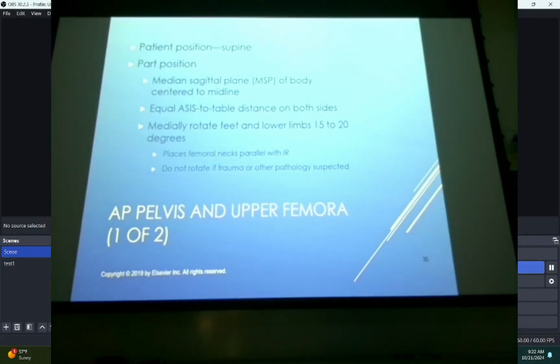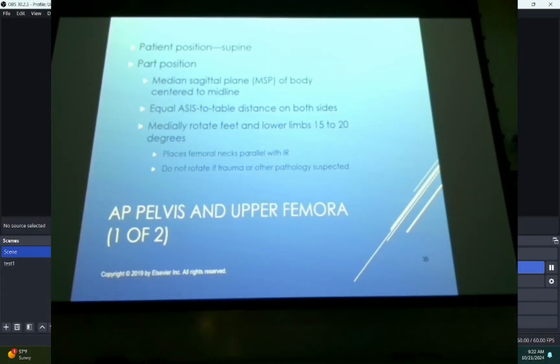Have the patient hold their breath. Most of your lower extremities, you don't have to have the patient hold their breath, but I would recommend it in this one just to kind of keep the bowel movement down if at all possible.